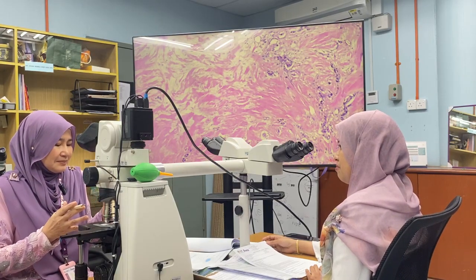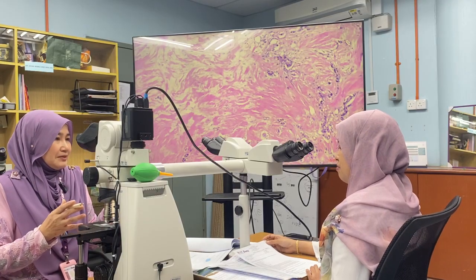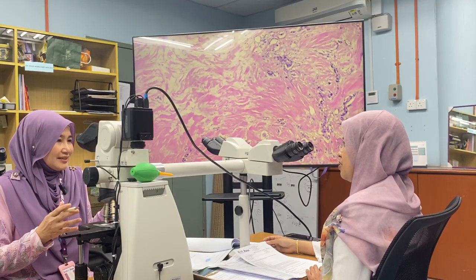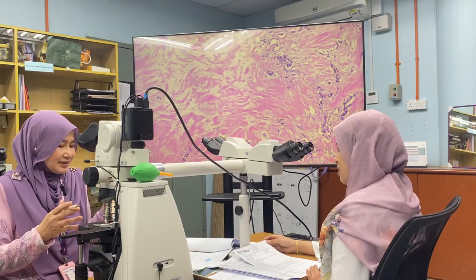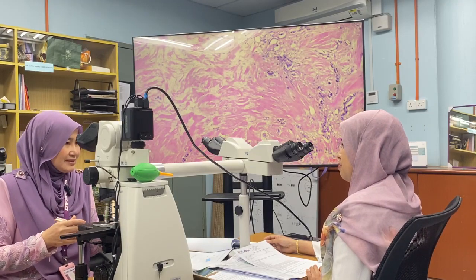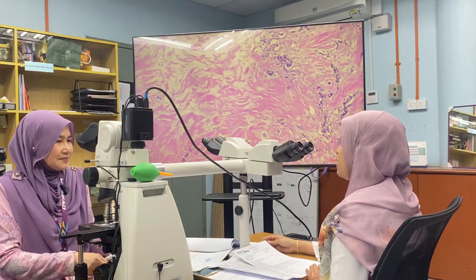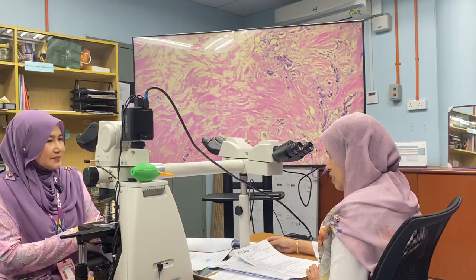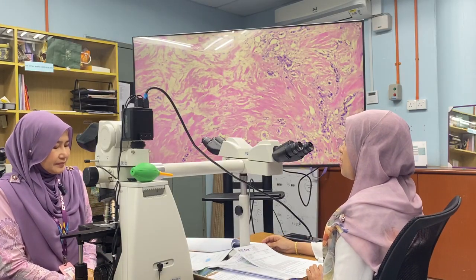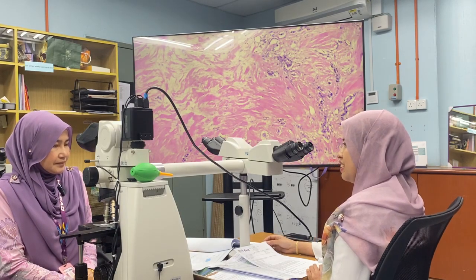Maybe now, as in the main tumor, they will be replaced by a histiocytic reaction within the DCIS ductal component, or there are cell changes. Can you please tell what the changes of the cell post-chemo are? Chemo-related changes: the cell can have vacuolated cytoplasm, nucleomegaly, coarse chromatin, and also degenerated, necrotic cells.